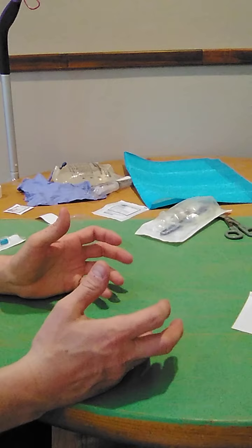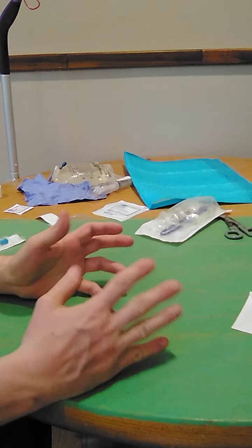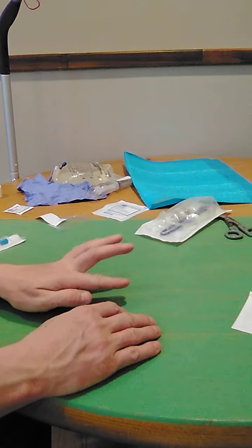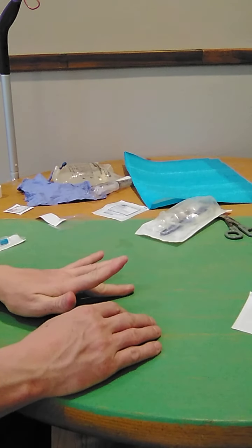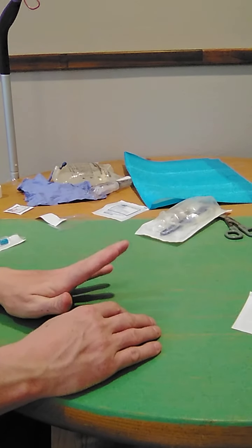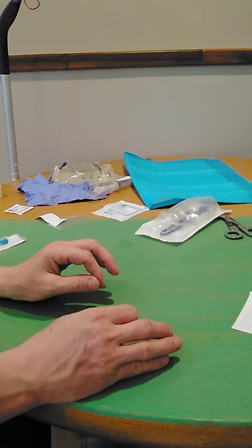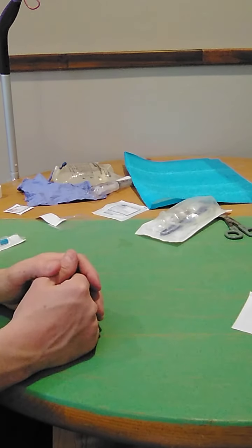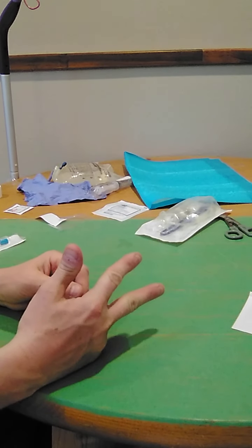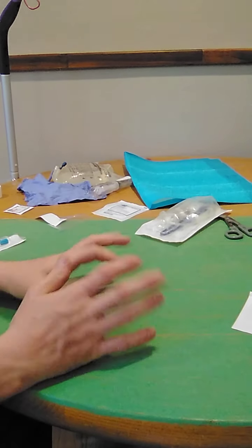And I'm going to start by reviewing the completeness of the provider order, its accuracy, and that it's for the appropriate patient, the correct amount of IV fluid, the correct type of IV fluid, any type of medications that ought to be added, the infusion time that it ought to be started, the duration of the infusion, and the time that may be specified to end the infusion, as well as the purpose of this infusion.